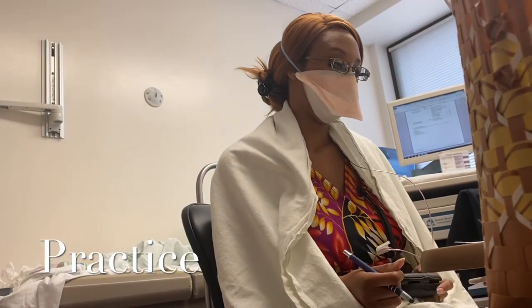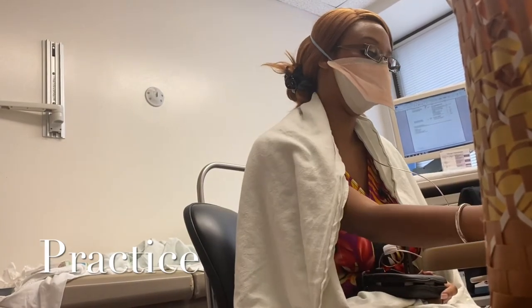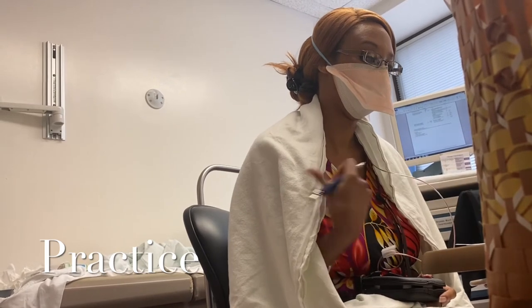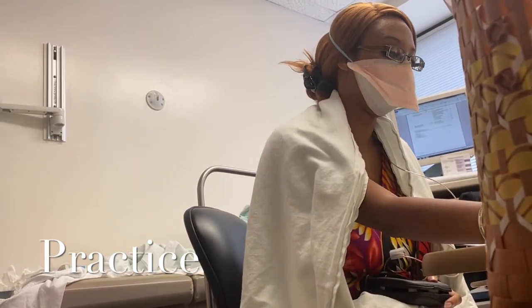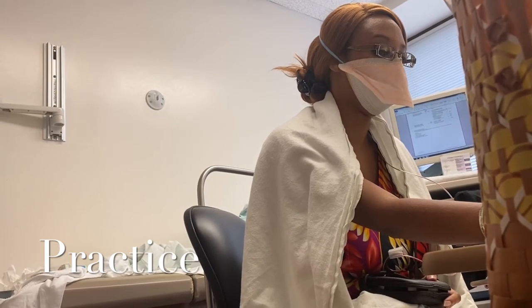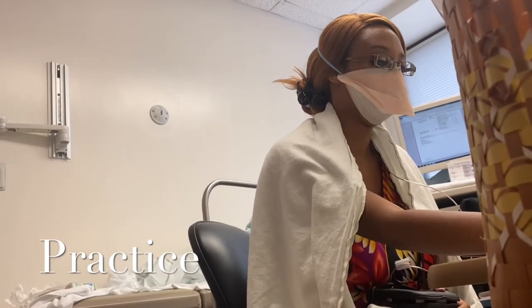Any questions on that? Now when you go to the bathroom, if you go in the middle of the night, they say if it's 5 minutes or less, you don't have to change it. But if you're up longer, then you change it. Okay? Thank you very much. Any questions on those? Okay. No? All right. So now we're going to practice the symptoms.